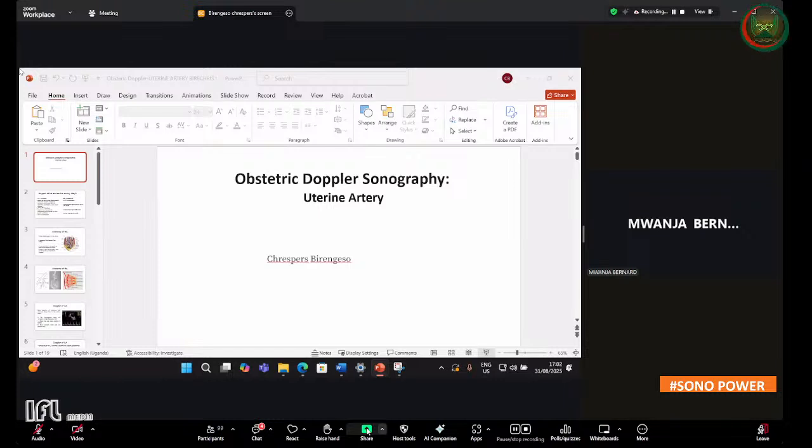Yes, a reminder, if you have a question, put it in the chat. The panelists will be able to answer all the questions at the end of the presentation. We first of all looked at fetal circulation, then physics and hemodynamics, and just now Mr. Birenges has been talking to us about the uterine artery. Next, we are going to be looking at the umbilical artery. We have a presentation by Naume Barije.